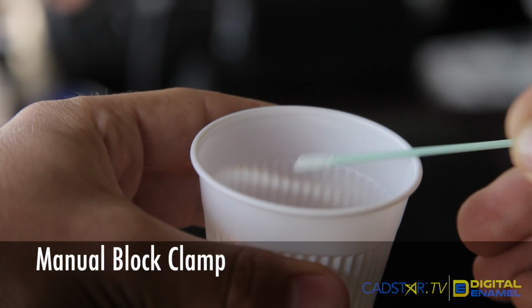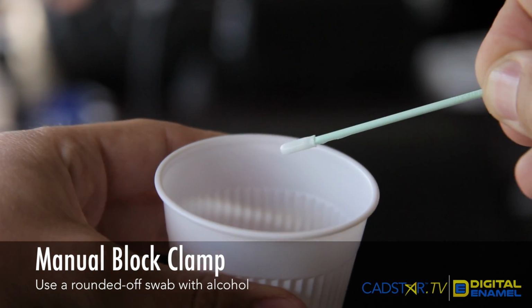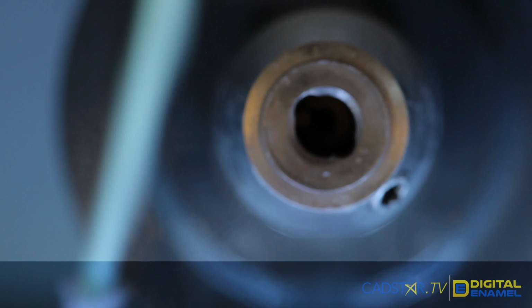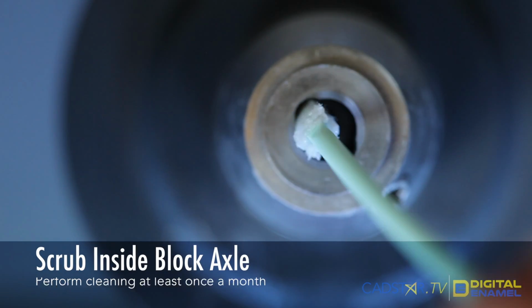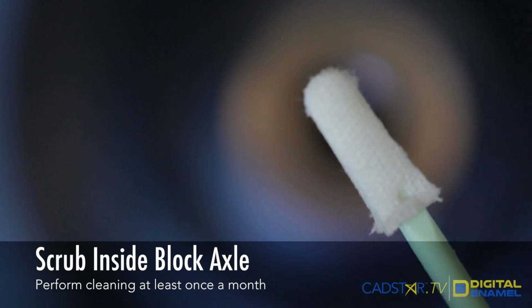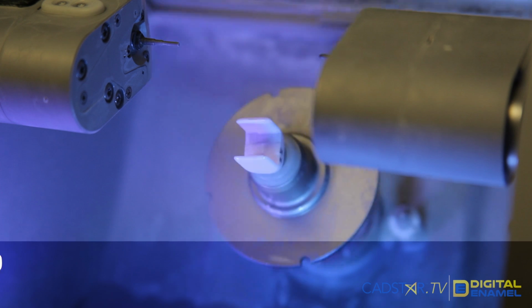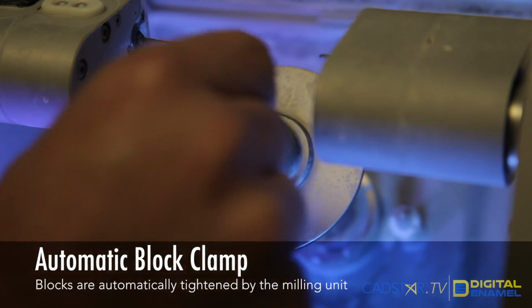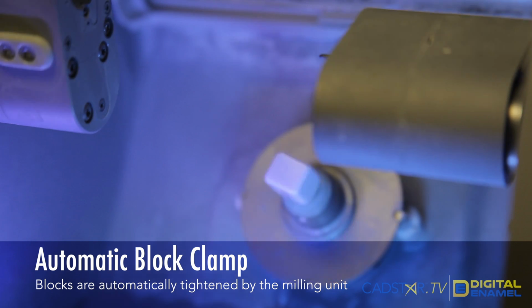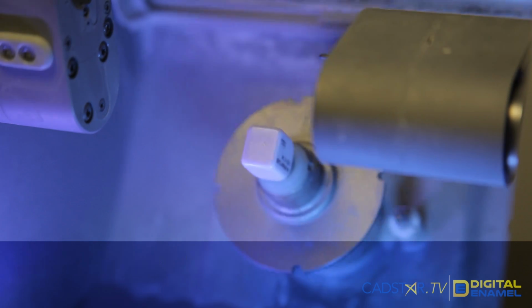For the manual block clamp, all we're going to do is take the rounded off cotton swab, dip it in alcohol, and just clean the inside of the block axle until you don't see any dirt. And that's the extent of the regular maintenance that we're going to do for the manual block clamp. Now you're done. For the automatic block clamp, you'll see that this will automatically tighten the block once it's in there. All you do is place it and it will spin and lock it in.